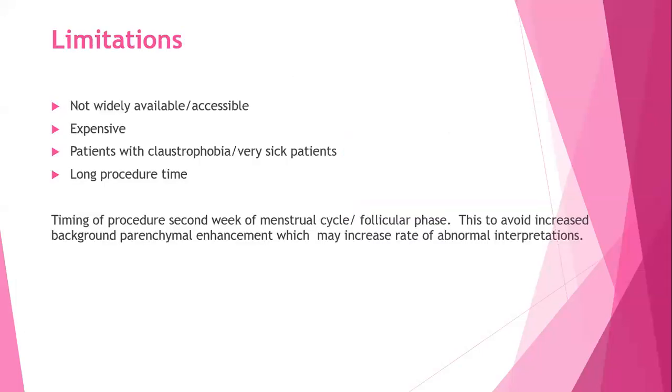So limitations: MRI is not widely available or accessible. It's an expensive modality also. And there's also the claustrophobia aspect. Patients who are claustrophobic may not be able to stay still in an MRI machine. And remember, this is a modality that is very sensitive to any motion. Patients who are very sick may also not be able to withstand the long scanning times. Ideally, when we are doing this exam, we try to time it in the second week of the cycle so that we avoid increased background parenchymal enhancement, which can lead to abnormal interpretations.